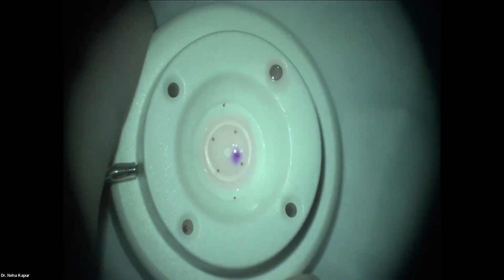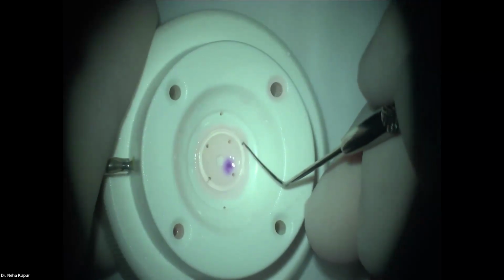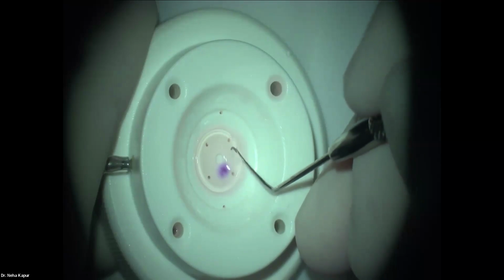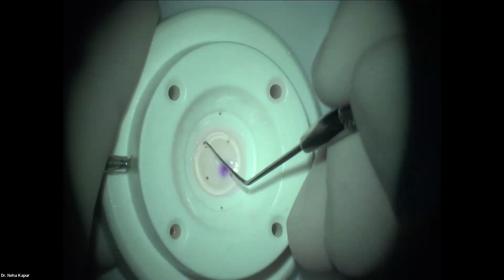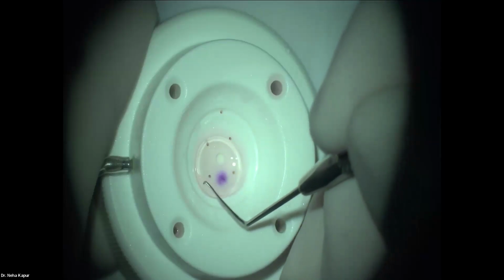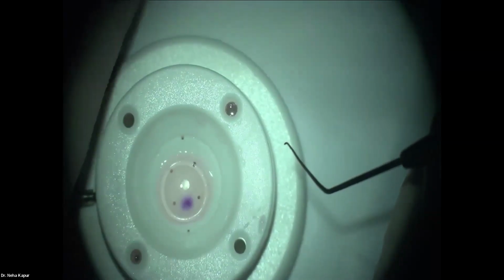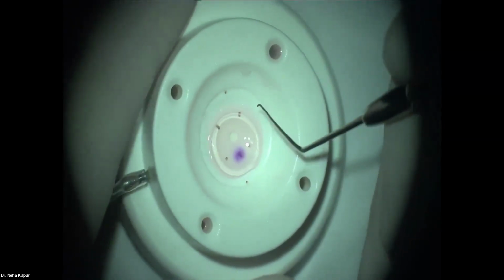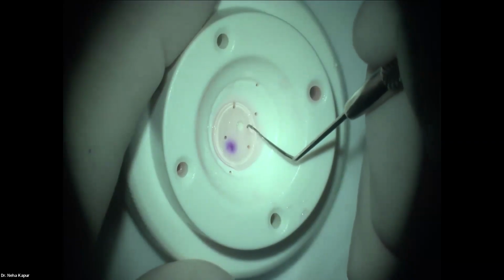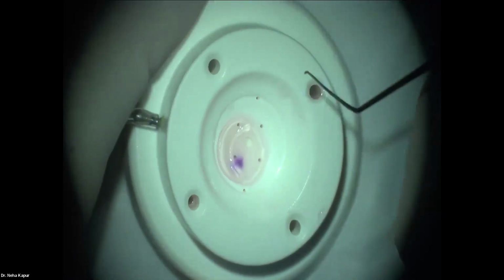Dialer. With the dialer, we have to make sure that the tissue is 360 degrees separated. This is in the interface to ensure a 360-degree cut. And once you ensure a 360-degree cut, we fold the tissue on one side so that we can put a clear mark for delineation inside the eye. So we go in the interface and just go ahead and fold the tissue.